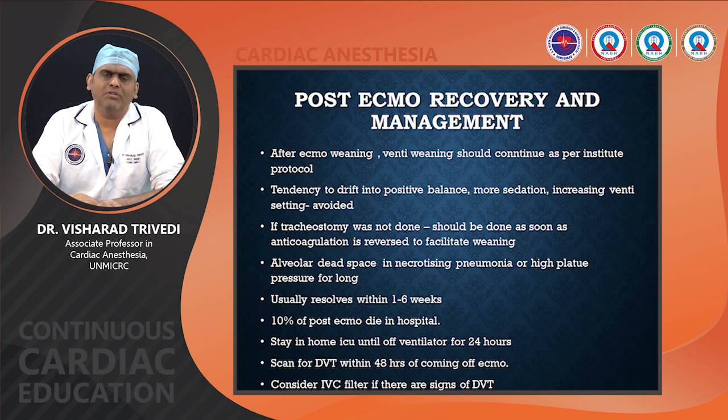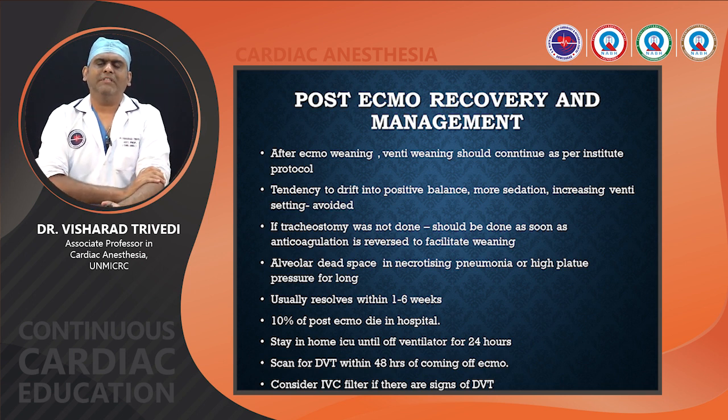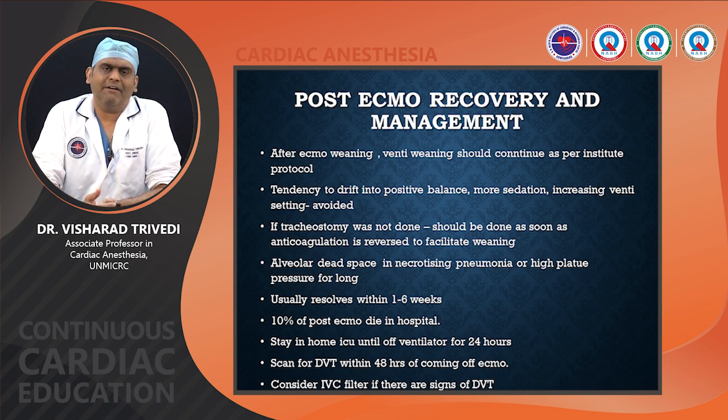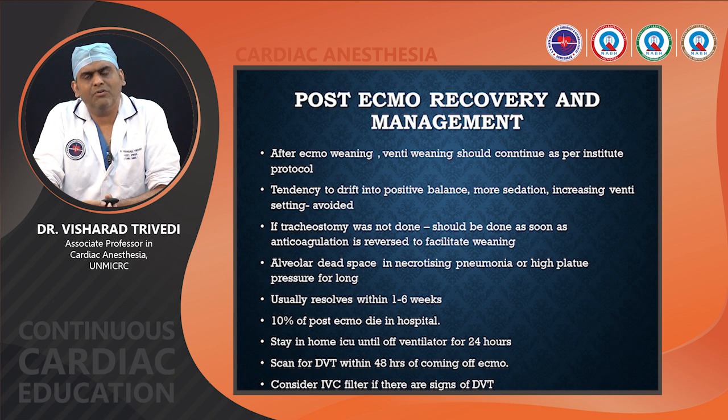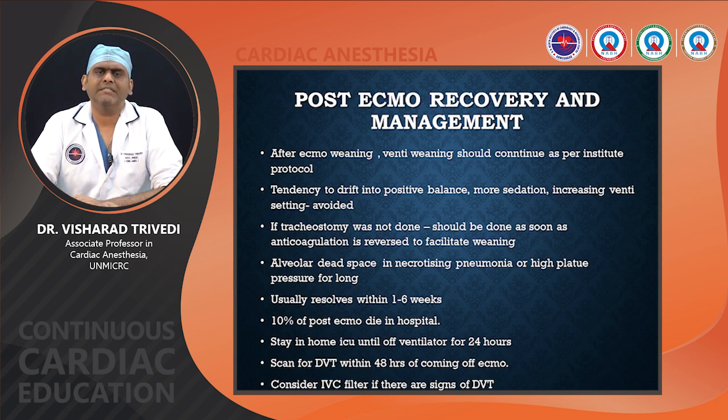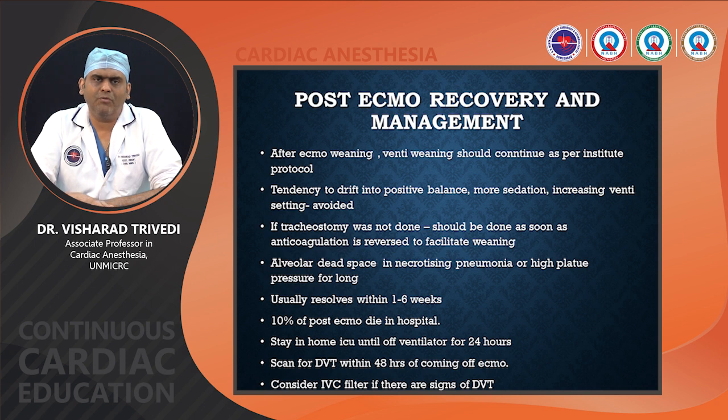Usually after Veno Venous ECMO, the lung function resolves within 1 to 6 weeks. 10% of the patients will die in the hospital itself after removal of the ECMO because of secondary complications as well. Some patients need home ICU care and ventilatory care at home for 24 hours even after removal of the ECMO. So even after removal of the ECMO, you have to keep a very vigilant watch on the gaseous exchange as well as other systems or secondary complications of the ECMO.